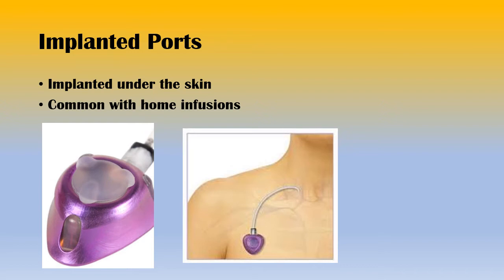It's implanted under the skin and it goes into central venous circulation, just like a PICC line, but it's more permanent. It's an access point that can stay there for many years.